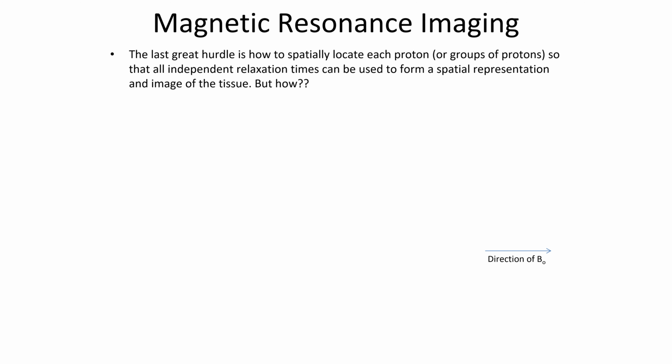Obviously, NMR doesn't do this. When you put a chemical substance in your NMR machine, it just tells you what is there. It doesn't tell you where it is. So how could you possibly do this? This is sort of a Socratic question. How would you do it? If you could come up with this, obviously you would also be a brilliant inventor of the MRI machine.